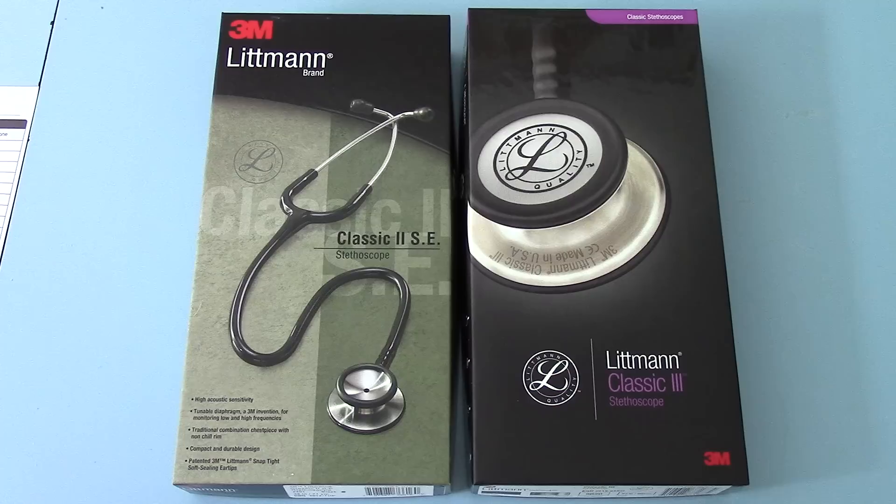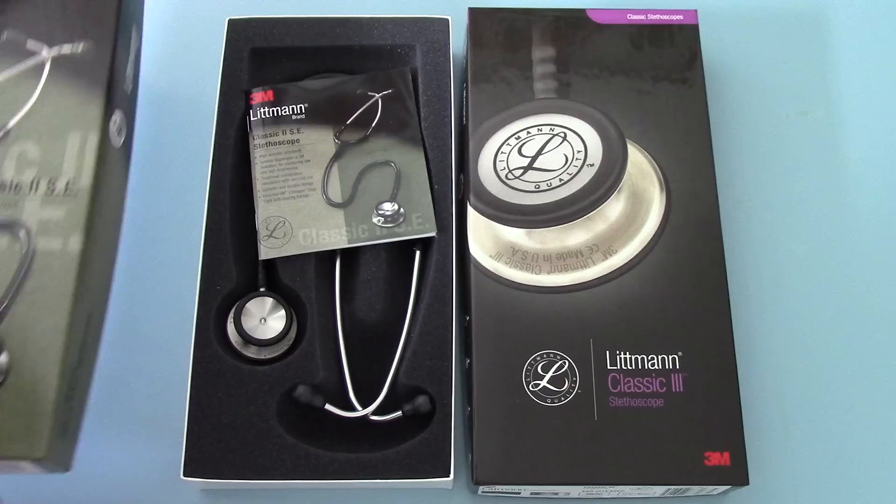Welcome to this product demonstration video. What we've got in front of you here is the Littmann Classic II SE, which for many years has been the benchmark stethoscope for doctors, and on the right we have the new Littmann Classic III stethoscope. We're often asked what is the difference between these two models, so we're going to run through some basic changes and show you the difference between a Classic II SE and the new Classic III.